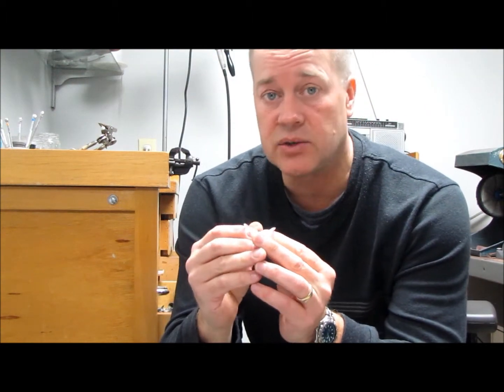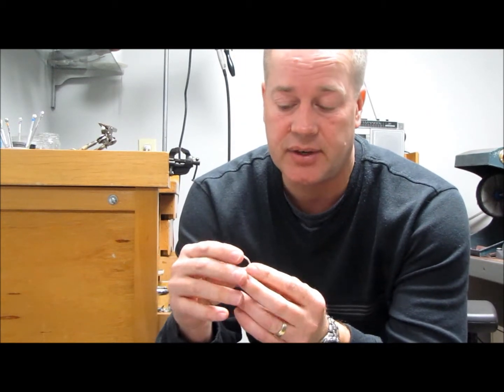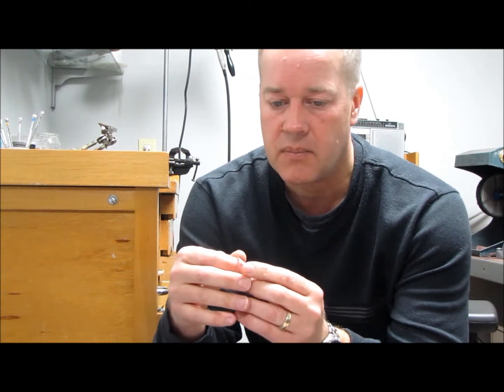I'm going to be talking to you today about the swan neck splint, or the anti-swan neck splint, which is an ideal splint for Ehlers-Danlos. Ehlers-Danlos is an issue with hypermobility. We have individuals here who've contacted me saying, I need a splint. But there's really not a lot of support or knowledge in Canada. The association barely exists for EDS.